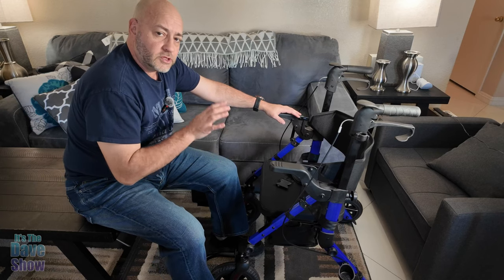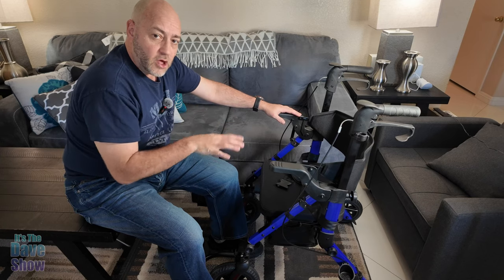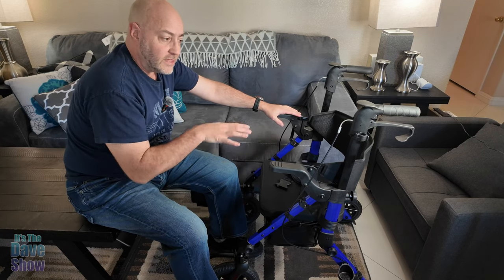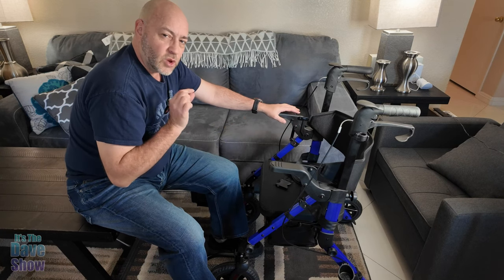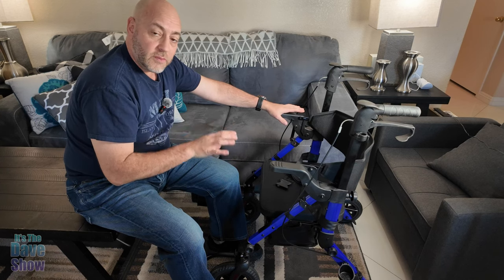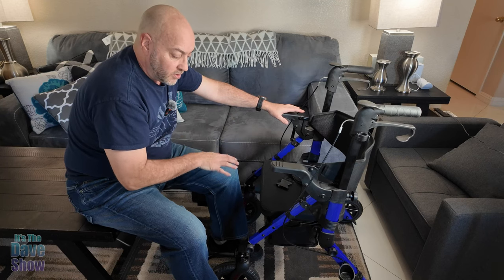It was very easy for mom to walk down the hall, and I was also able to wheel her down the hall in it. Now, this is a transfer chair — designed primarily as a walker. You can use it as a full-time walker, no problem. As a wheelchair, it's not really designed for that, but it's designed for short distances: from a house to a car, or from a bed to a bathroom.